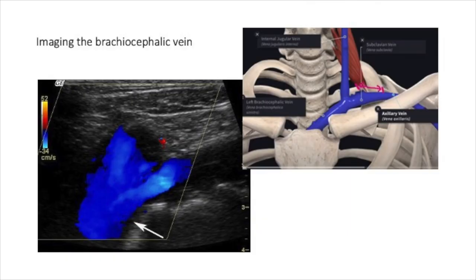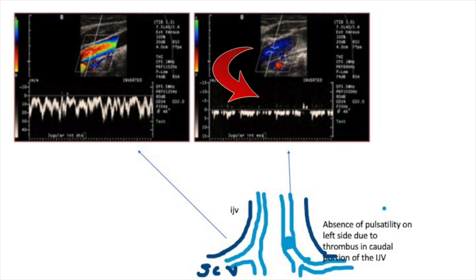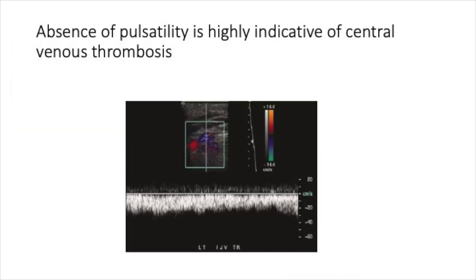It is always a good habit to document the cranial-most portion of the brachiocephalic vein in your scans. Here is the anatomical representation of the internal jugular and subclavian joining to form the brachiocephalic vein, and exactly the same thing is shown in the color Doppler image. On the right you have a completely patent neck venous system showing typical pulsatility, whereas on the left you can see a thrombus occluding the IJV, and when you sample the cranial portion of the IJV you see loss of pulsatility, because the thrombus is not allowing cardiac pulsations to be transmitted through into the proximal vessel. Absence of pulsatility is thus highly indicative of central venous thrombosis.